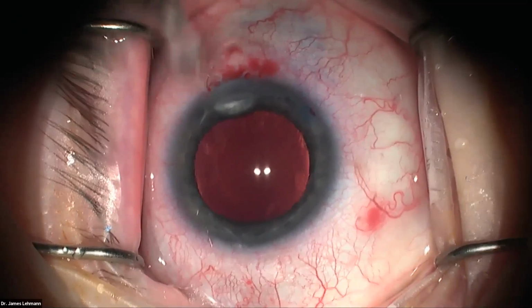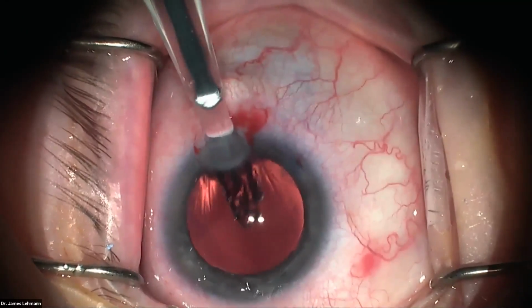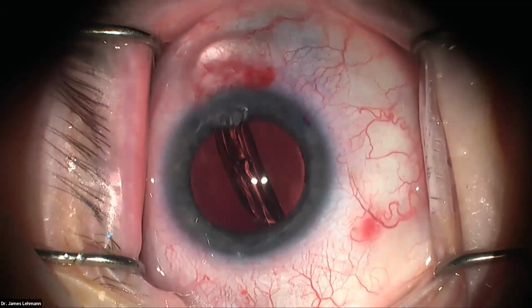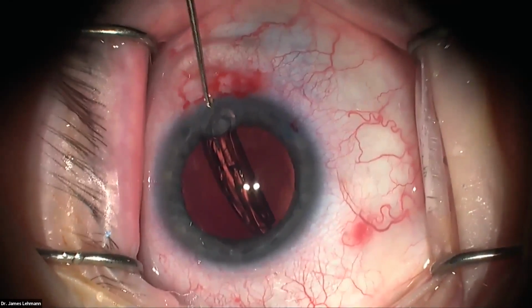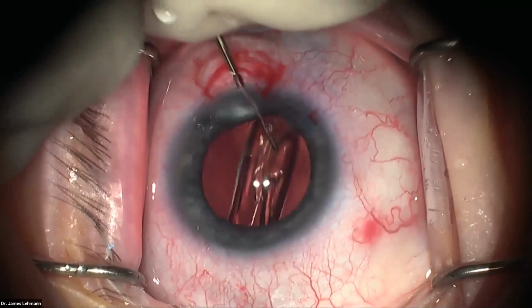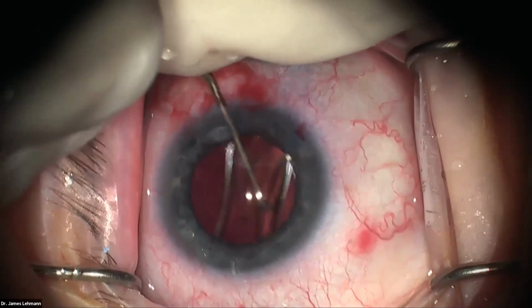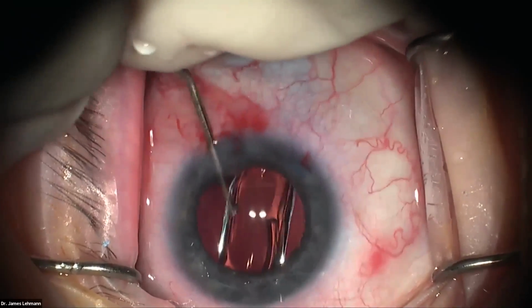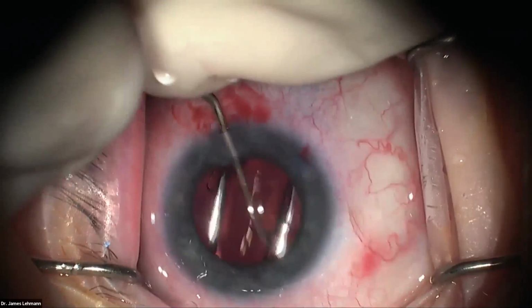And it's a one-piece hydrophobic acrylic lens, clear. Nice, good material, no glistenings, no chromatic aberration. And you can see my technicians loaded it excellent. And now I'm just going to use this thing called a push-pull or a Kuglen. And I'm going to put it into the bag. And while it unfolds, I'm going to kind of tap the haptics here and get them to open up a little faster. And then there we go.